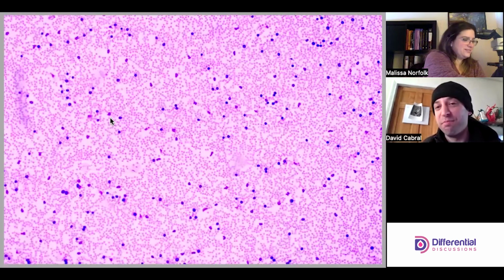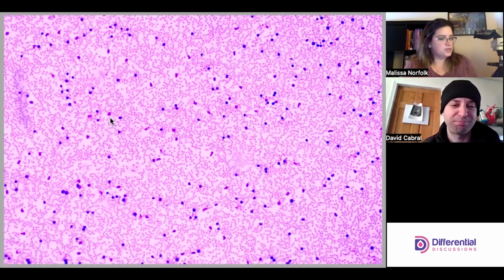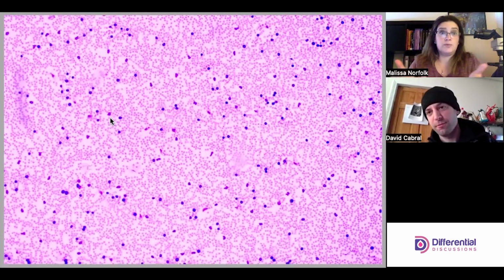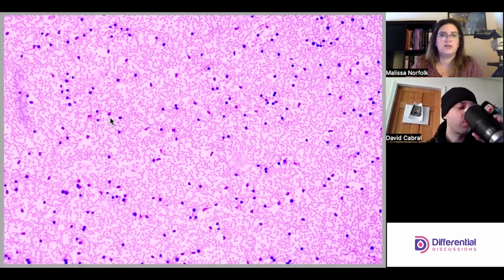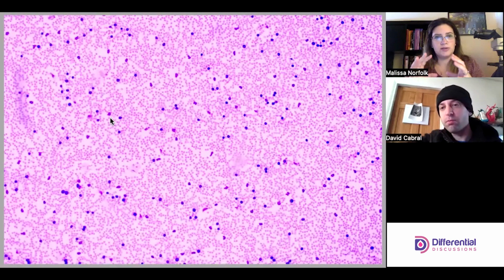They look prettier in a lot of ways, I think. Well, we'll look at this after. This is the same slide, just with albumin. Awesome. And just for a little background, the reason we do the albumin is because it's protein. It just coats the cells. The smudge cells are not smudge cells in your body. They're smudge cells because of the smear-making process. So essentially what we're doing with the albumin is coating the cells to strengthen them.